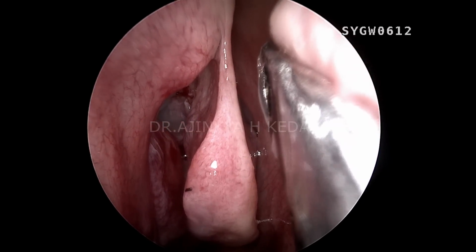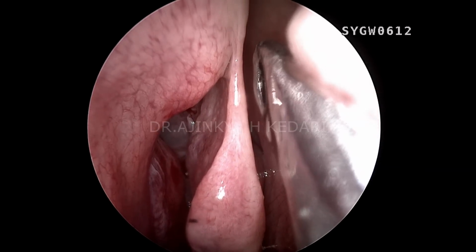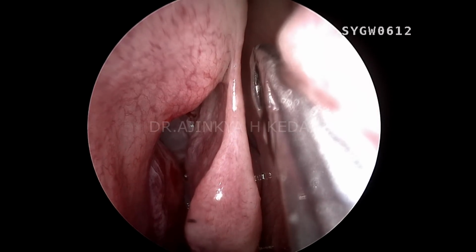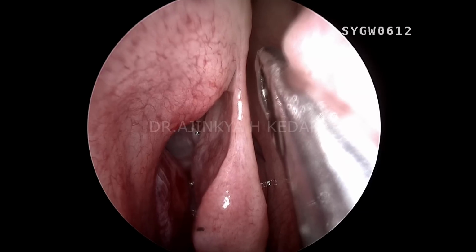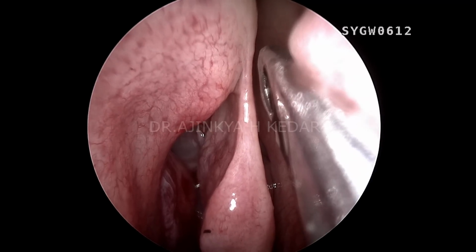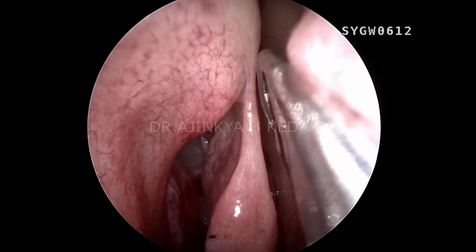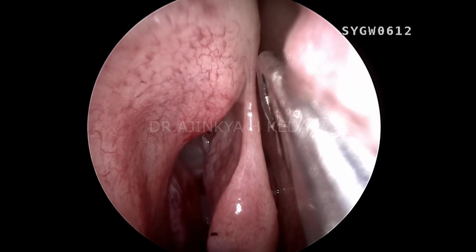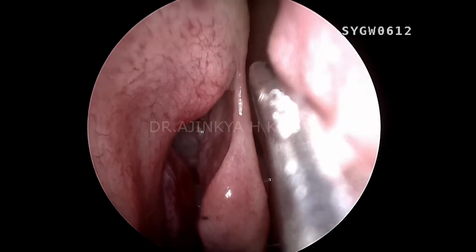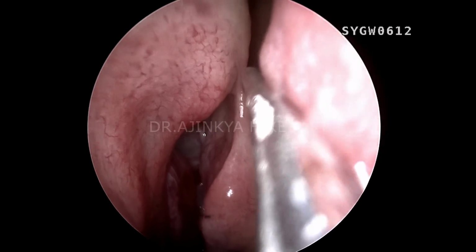I'm going to put pressure on the septum with the suction freers and try to cause microfractures in that part of the septum, so it becomes much more erect. If you break the continuity of the deviated septum by fracturing it, it tends to stay erect for a longer time. That will give you temporary access to the blocked area.